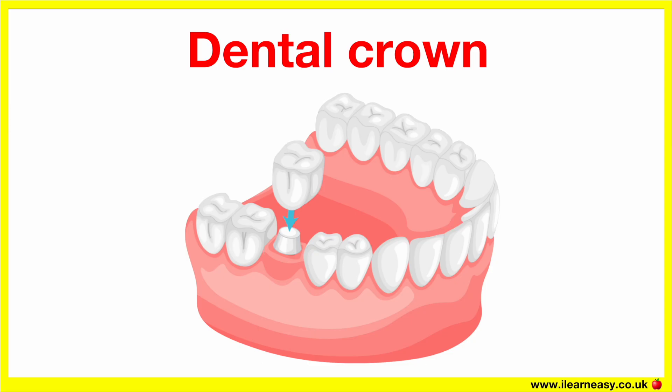Dental crown. A dental crown is a type of dental restoration that completely caps or encircles a damaged or weakened tooth. It looks and functions like a natural tooth. A dental crown is a custom-made cap placed over a tooth to restore its shape, size, strength and appearance. You can think of it as a literal crown that sits on top of a tooth that's weak or damaged.